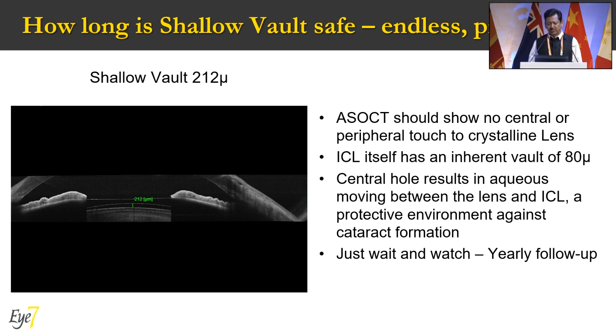Just keep observing. As long as the aqueous is coming under the ICL, the aqueous is lifting up the ICL to some extent. We are just observing, and normally for years together, nothing ever happens.